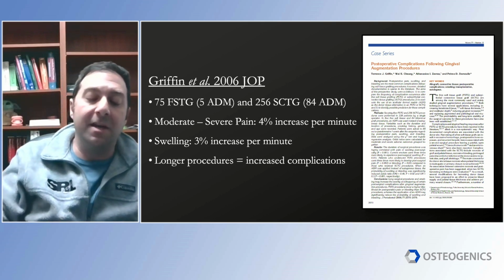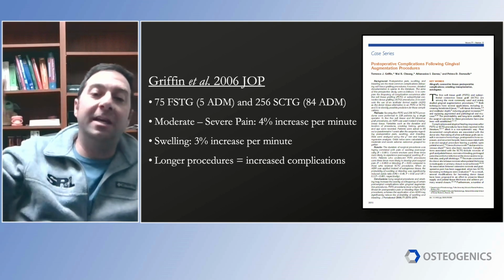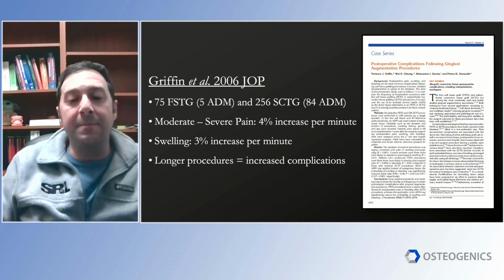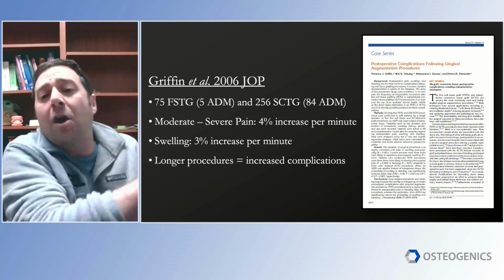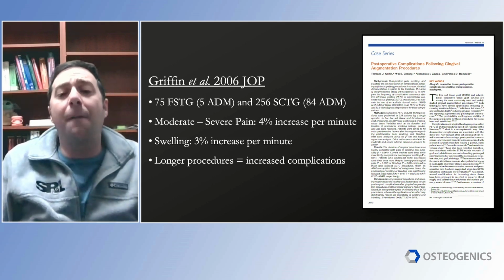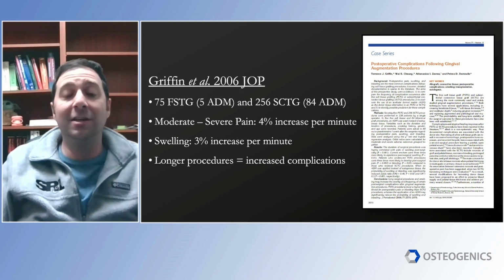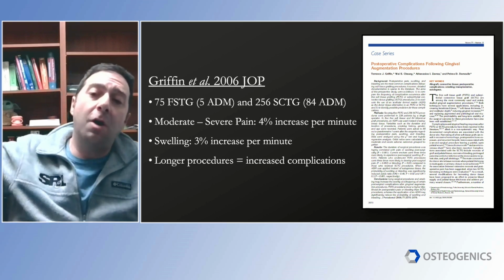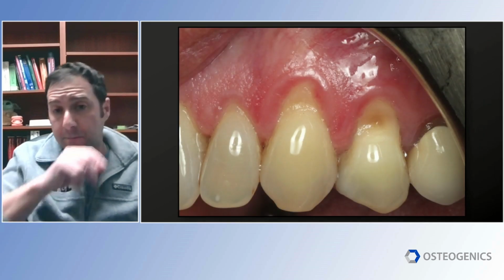So what does that tell me? That tells me that longer procedures, we all know this, equal increased complications. I teach at Ohio State. When a resident comes to me and says, "Why did my graft fail? Doesn't it look perfect? Look at all these photos. These photos are all perfect," I say, "It's because it took you 3 hours. You do anything for 3 hours, it's not going to go well." We all know the longer a procedure goes, the more complications that we have.